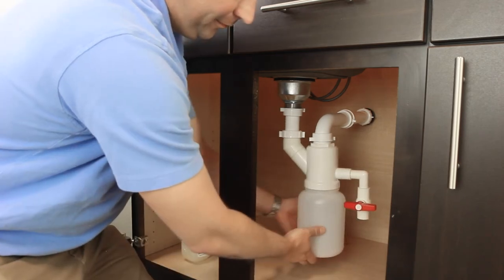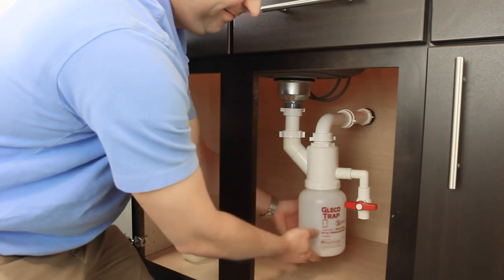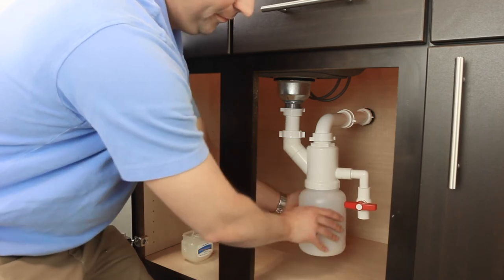Now simply screw on the new bottle, making sure the side drain is in the horizontal off position. And your GlecoTrap is ready to go again.